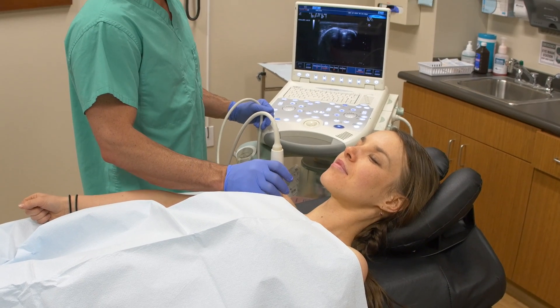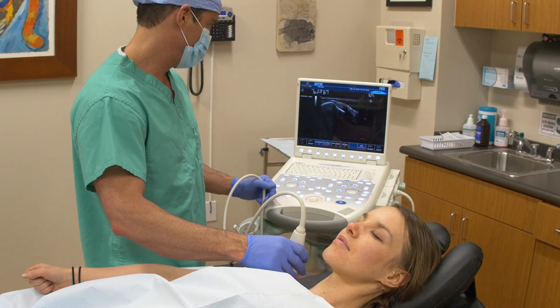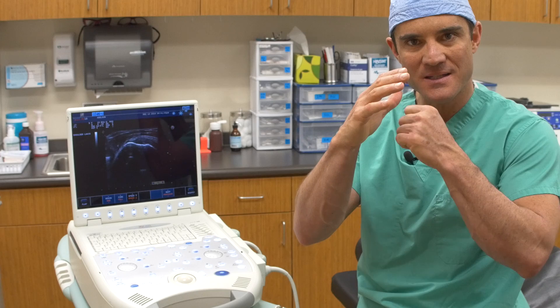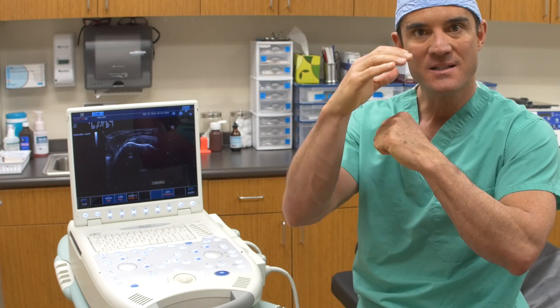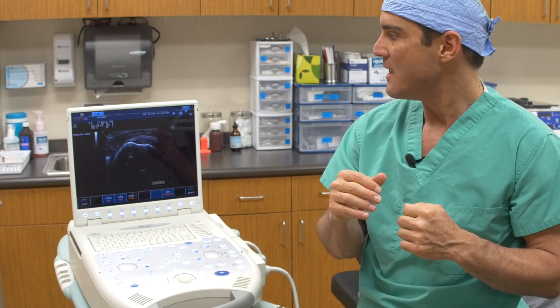Everybody thinks of MRI in this country as the gold standard for evaluating soft tissue, but ultrasound in the rest of the world is really the gold standard for many structures. You can't see down inside the joint — so if it's the labrum of the shoulder or the hip, the inside surface, the soft tissue lining of the socket portion of the ball and socket joint, you can't see that. But something that's outside the joint, you can see. I use my ultrasound every day — it's a wonderful tool.